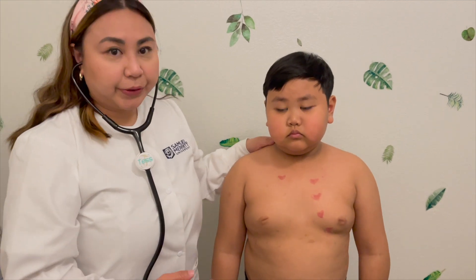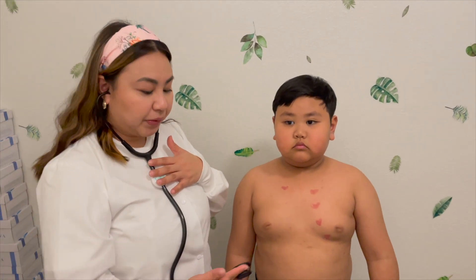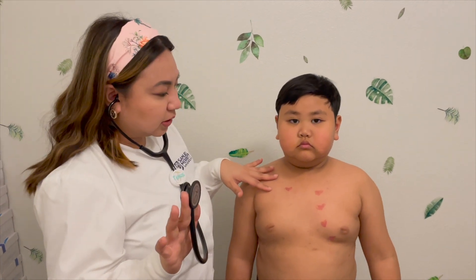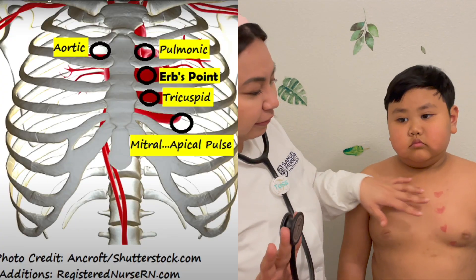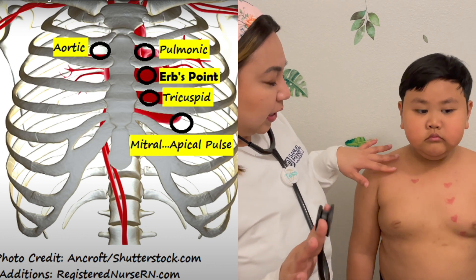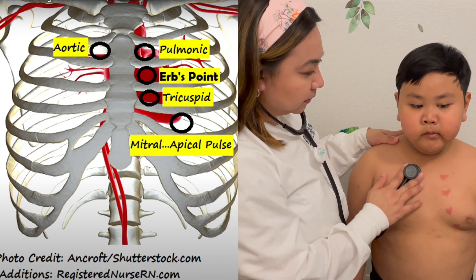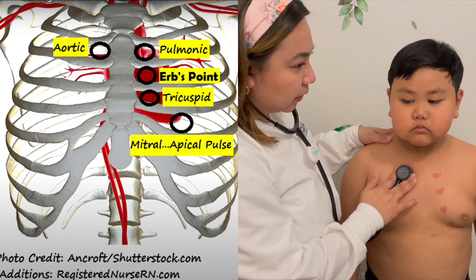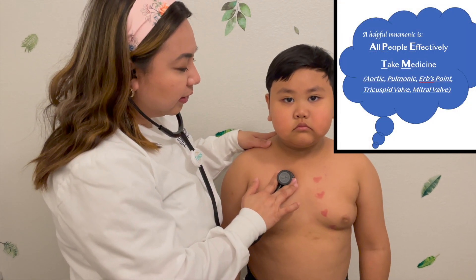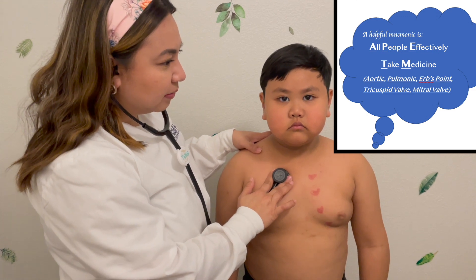Now, using the stethoscope, we're going to start with the diaphragm side and auscultate for five important points. I'm going to start with this one, listening for that lub-dub sound.